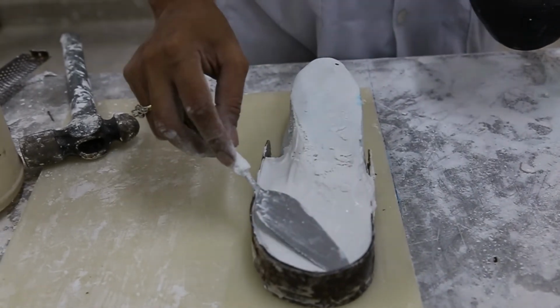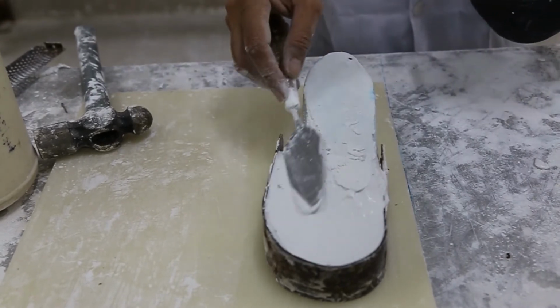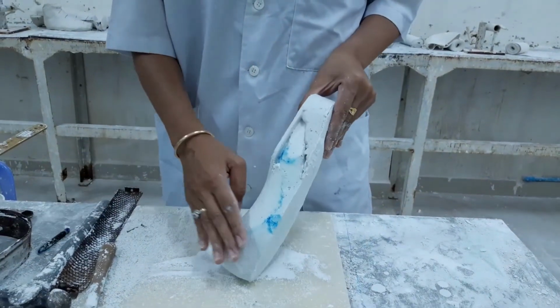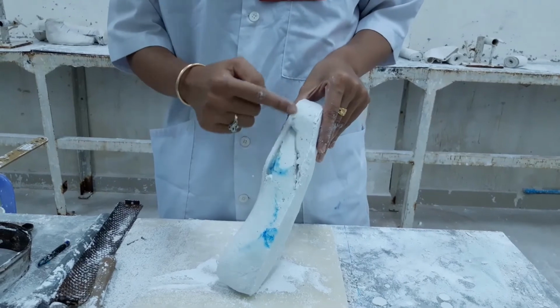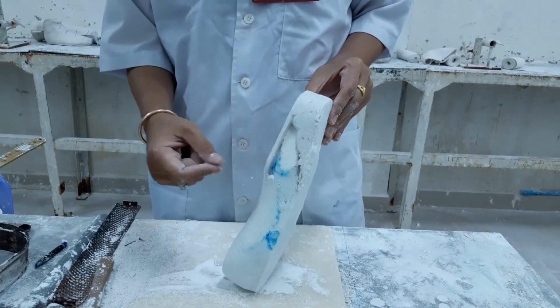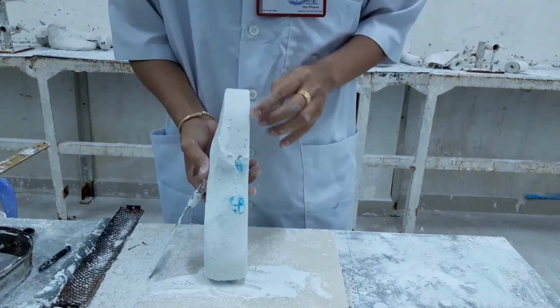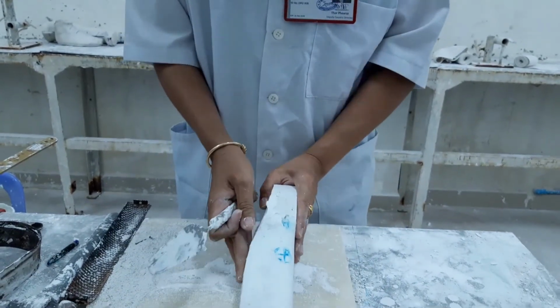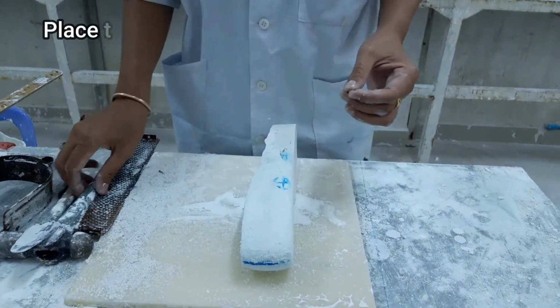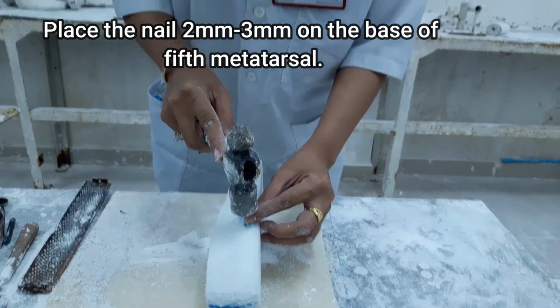I'm going to keep it for a few minutes, let it harden. Okay. So the places that we're going to build up, because after I extend the forefoot, it isn't fully filled with the plaster. So this part I'm going to build up, and the lateral side as well. It has a small hole, and the place that we're going to build up mainly is the base of the fifth metatarsal. So when we build up, we always put about 2 to 3 millimeters.